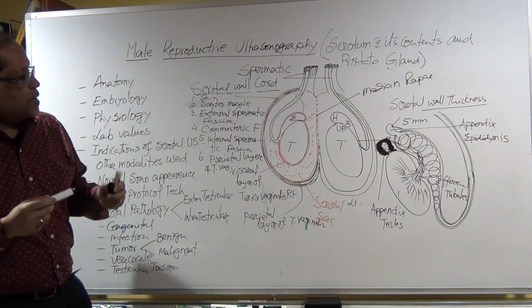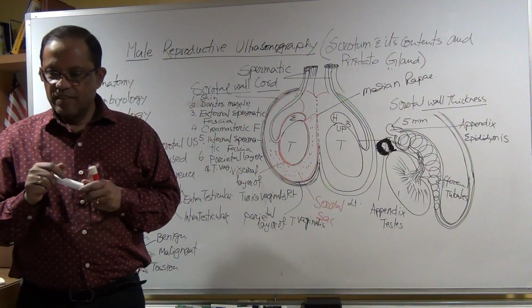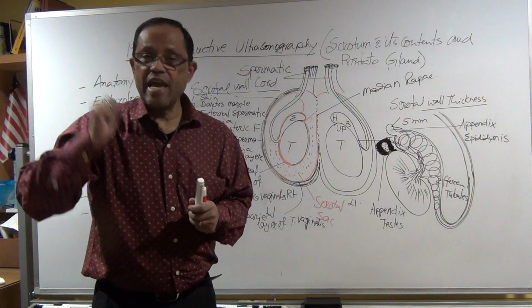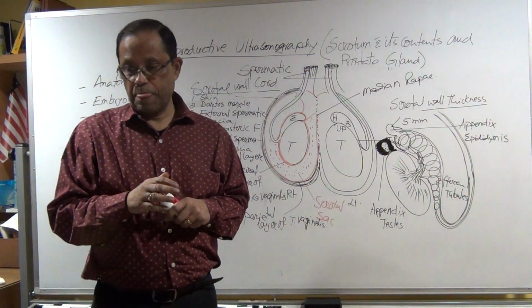Can we see the spermatic cord? Say yes. Yes, sonographically we can see the spermatic cord.